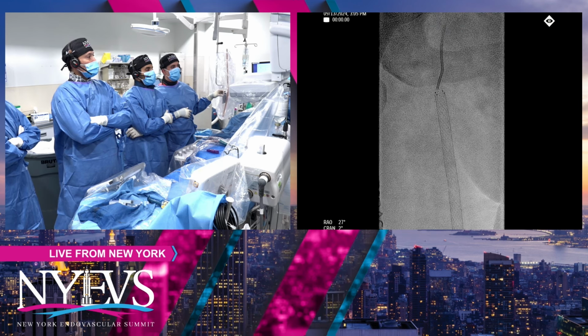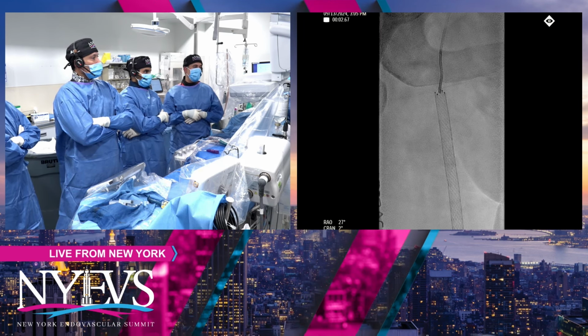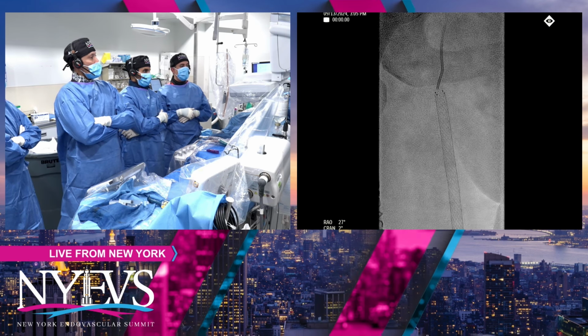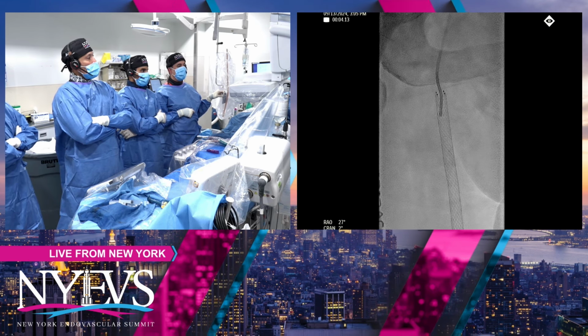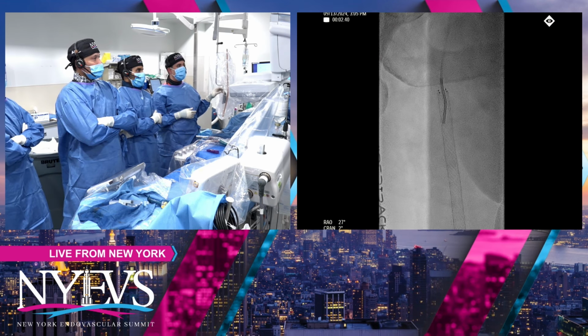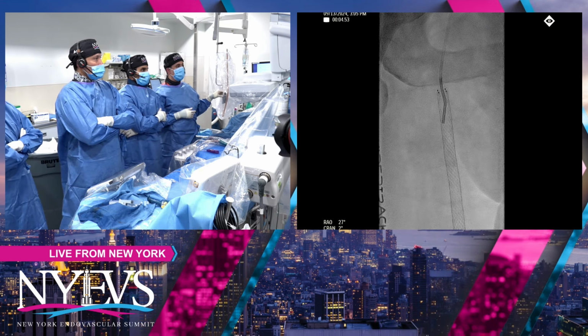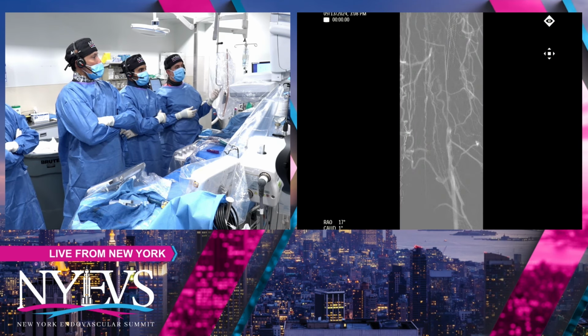We had a microcatheter wire technique. So we got a microcatheter down there. There's a 035 Trailblazer we used, trying to pop it, fish around and try to pop it, trying to make sure we are still in the stent because the wire would tend to go behind the stent. So we were able to get into the stent, and with our 035 stiff wire, we actually traversed all the way down till the end of the stent.